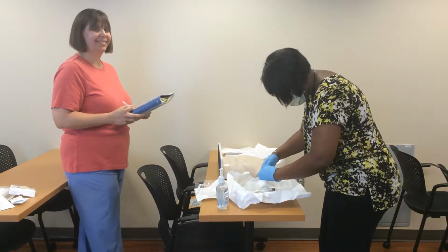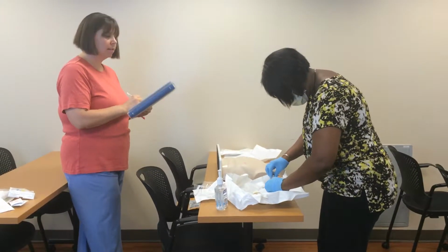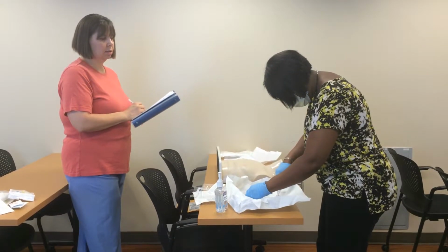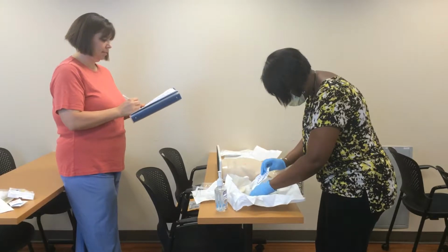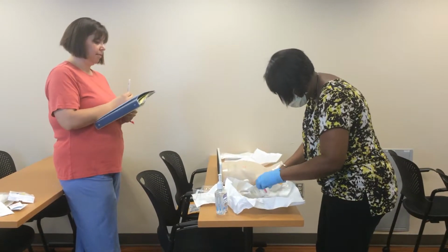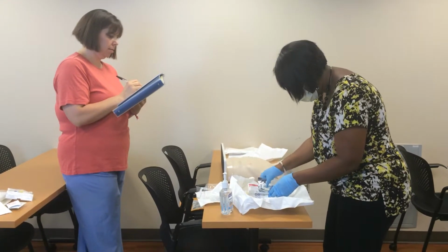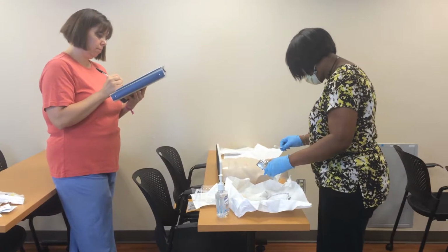And, now I'm just going to clean it here with some alcohol.